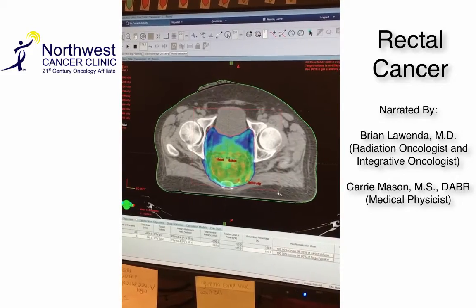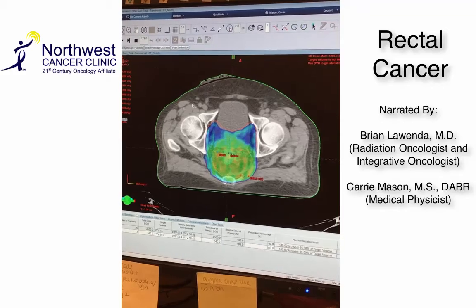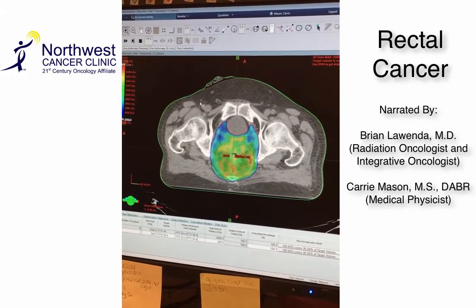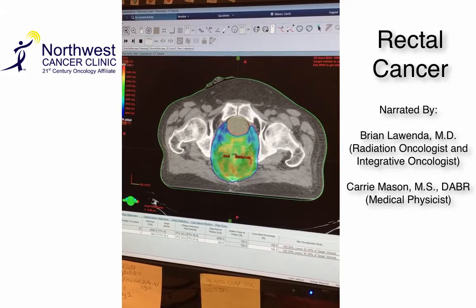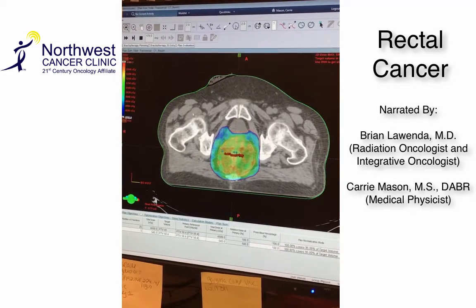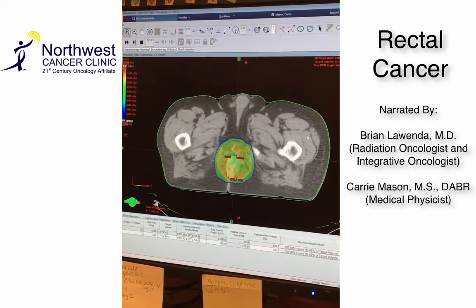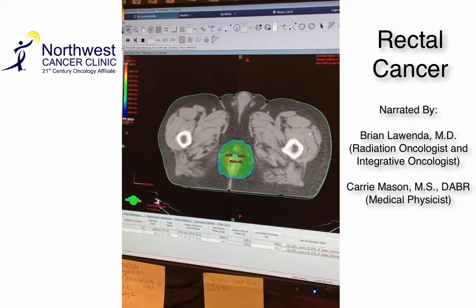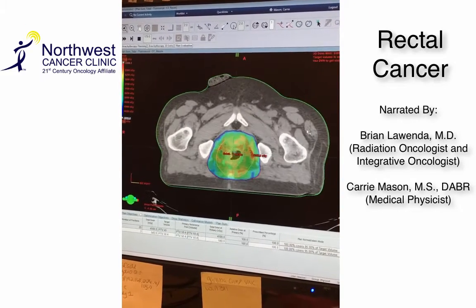Here we're looking at a dose wash, which is basically the amount of radiation that we're delivering to the areas we're trying to treat — which is the rectum and the lymph nodes. This is a preventative treatment to try to prevent any cancer recurrence in lymph nodes, as well as treating any tiny microscopic cells in the lymph nodes.